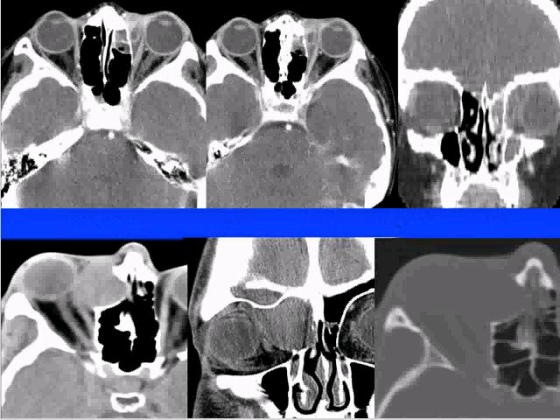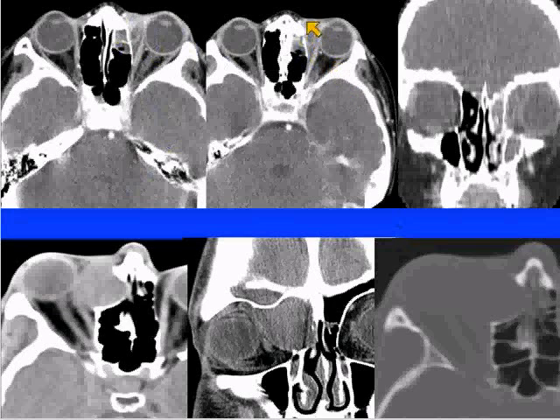Here are some other examples. This is a subperiosteal abscess. The key with a subperiosteal abscess: you want to see the adjacent ethmoid sinus disease. You can see the abscess within the medial canthal region with rim enhancement. You want to see some defect within the lamina papyracea, producing this cystic type of appearance.